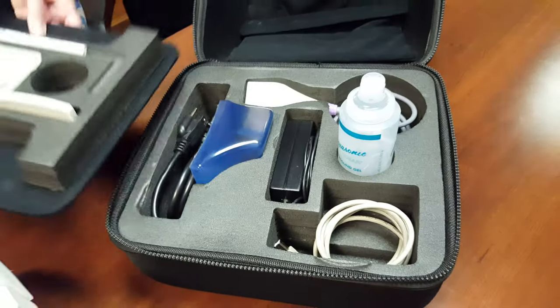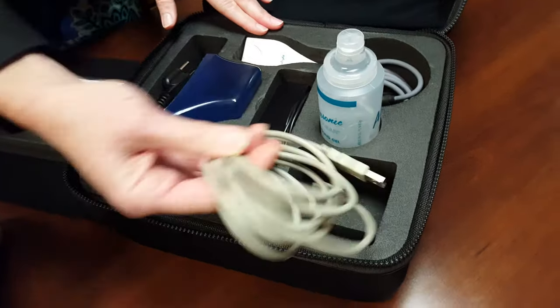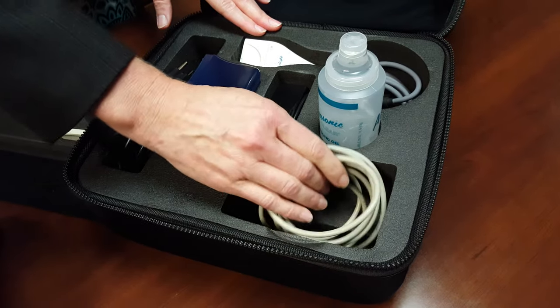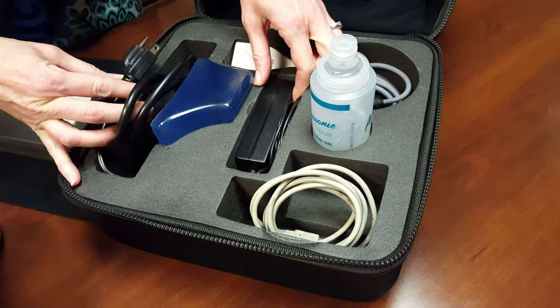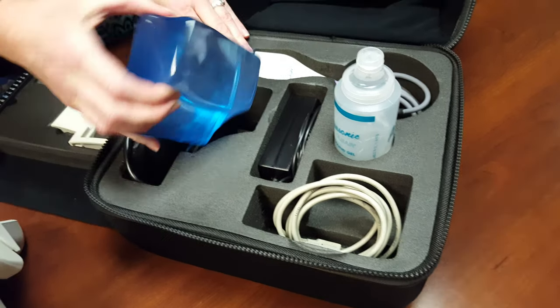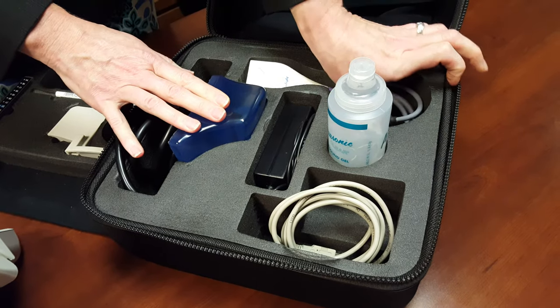On the bottom layer there are just a few more items: your USB cord to attach to your own computer, your power cord pieces, your armrest, and finally your probe.